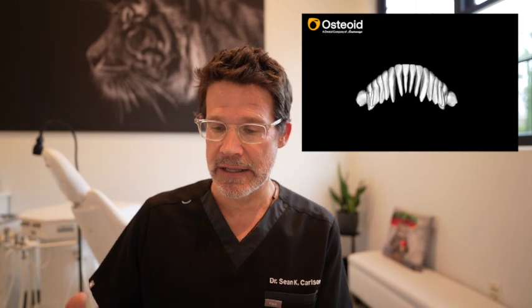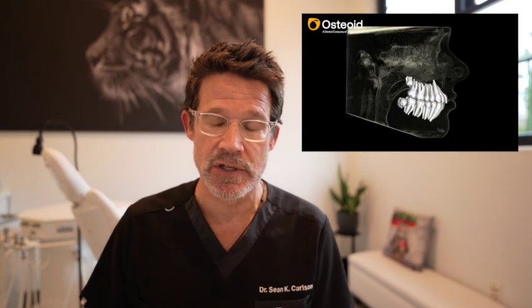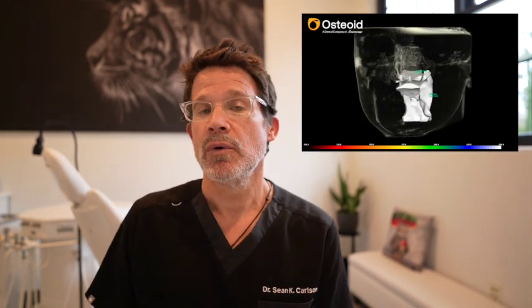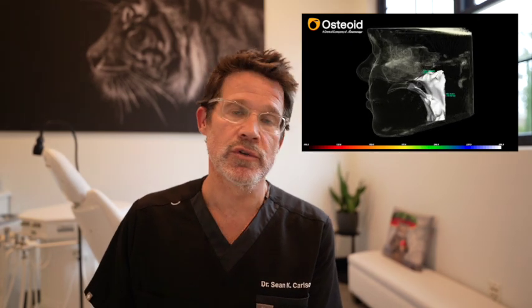So it's really powerful in terms of telling them exactly where I need procedures done, which teeth I need to have addressed. So for example, in our plans, we typically will color teeth that are set for extractions. We will color those red so there's no confusion at all for the surgeons when we send that information over.